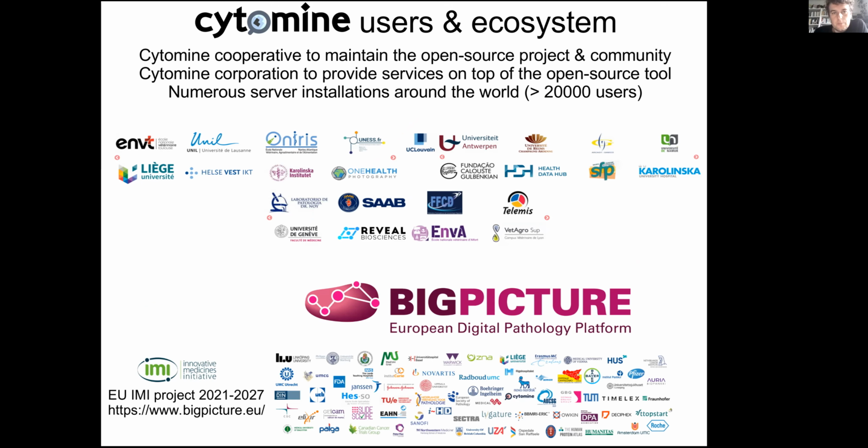And there is also a corporation, which I'm not directly linked to, that provides services on top of the open source tool. Just to let you know, we are also involved in a 6-year project, so we are continuing the development of Cytomine through this project and other projects.